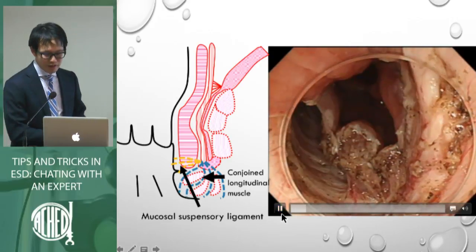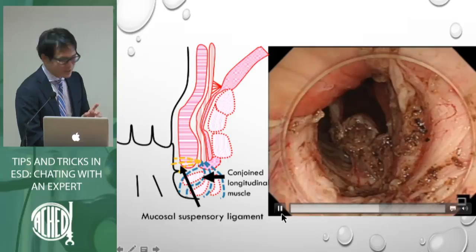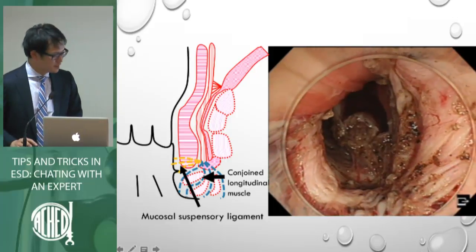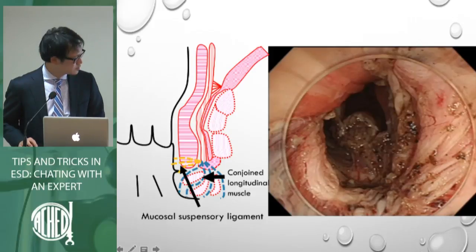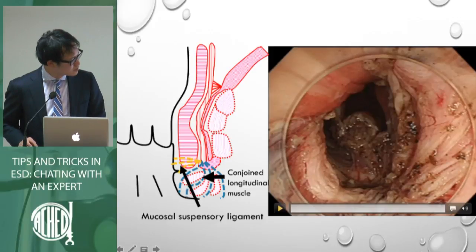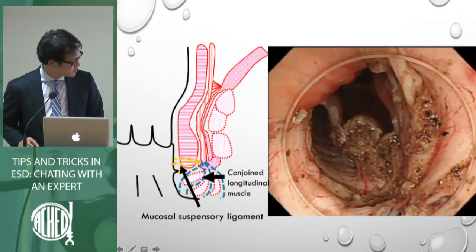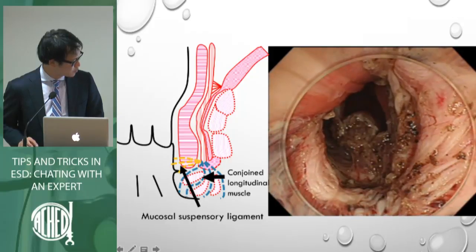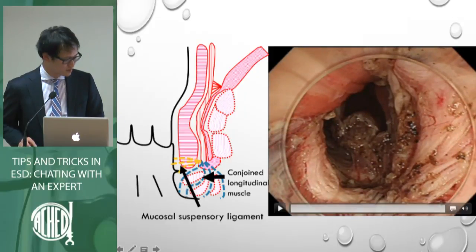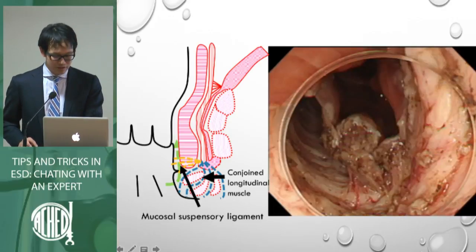So if you dissect over the mucosal suspensory ligament, you can see clear views. The anal area has a lot of ligaments. So we cut this mucosal suspensory ligament, and then it is easier to dissect these areas afterward.